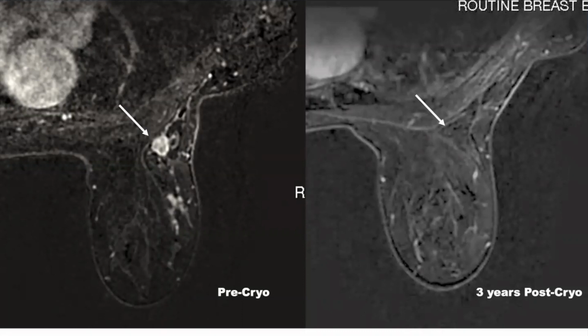Now, there is a type of breast MRI called diffusion weighted imaging, which does not use contrast. It is not widely available in the US. If you can find it, that's great. There is also diffusion weighted imaging done as whole body MRI, not just dedicated breast MRI. Whole body MRI doesn't have sufficient resolution to look at the breast. Even though it doesn't use contrast and it includes the breast, it doesn't look at the breast with enough resolution to guide cancer treatment.